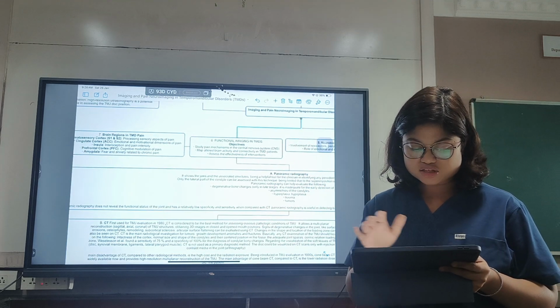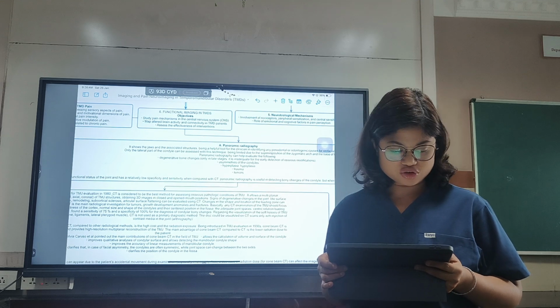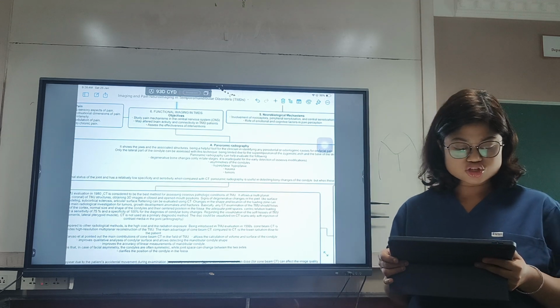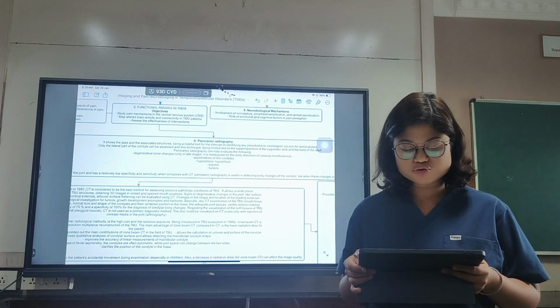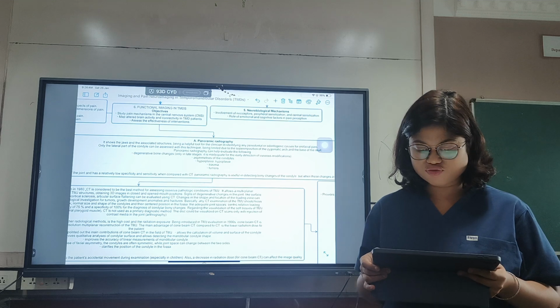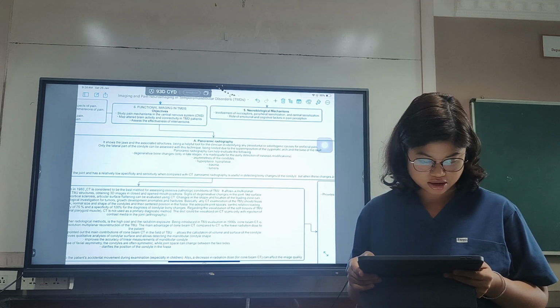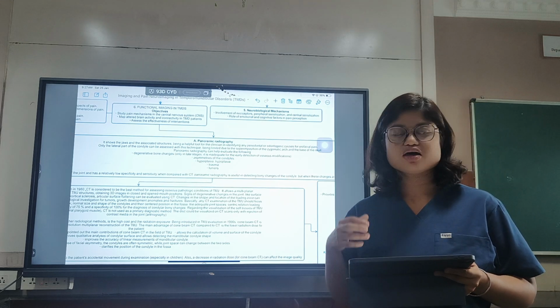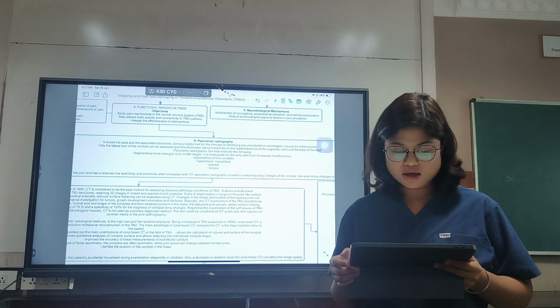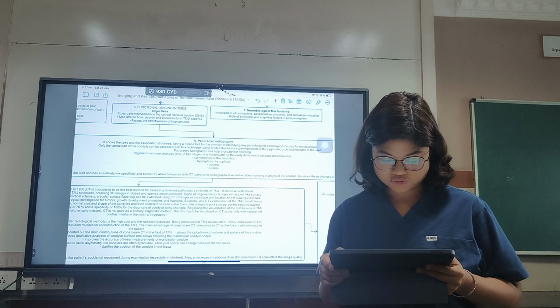So coming to the first modality, the simple basic one, panoramic radiography used in dentistry. It shows the jaw and the joints and the associated structures. It is a helpful tool for a clinician or a dentist to identify any periodontal or odontogenic causes of orofacial pain. Only the lateral part of the condyle is visible here, and this is a limitation because there will be superimposition of the zygomatic arch and the base of the skull.